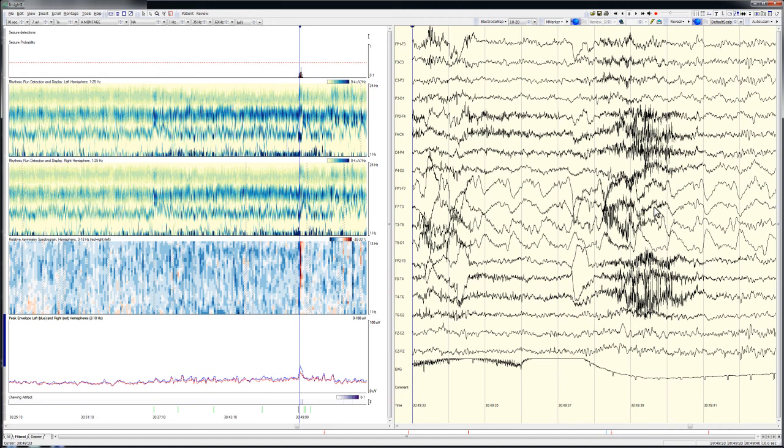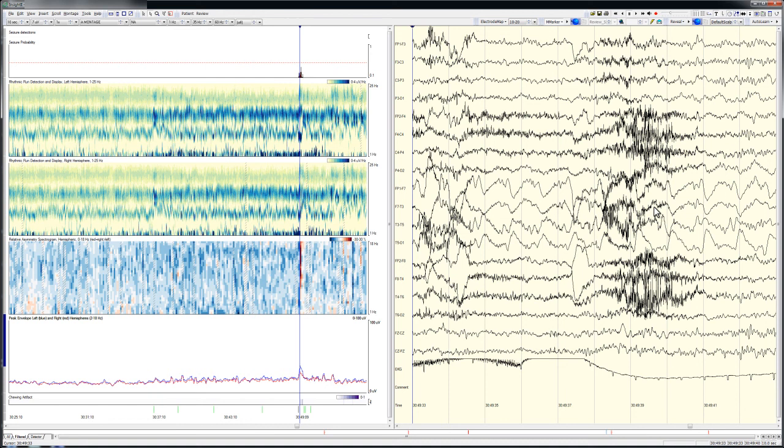Thus, in this case an 8 minute review of automated seizure detections and EEG trending graphs yielded more clinically important information than an expert 60 to 70 minute review of the entire EEG recording. Physicians or EEG technologists can use the same EEG review process as a first step to quickly identify most seizures and many other clinically important findings in prolonged EEG recordings. This capability allows the monitoring team to efficiently focus attention on events of interest early on in the review.